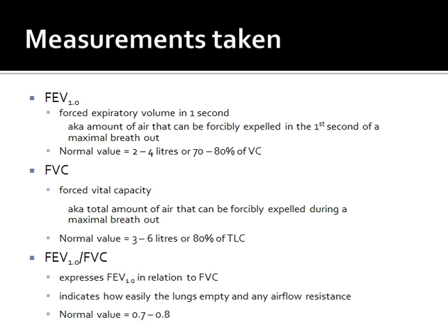The calculation then that we make is looking at both of those two volumes. So we look at the FEV1, the amount exhaled in that first second, divided by the total amount. And as I say, that should be about 80% of the total value.